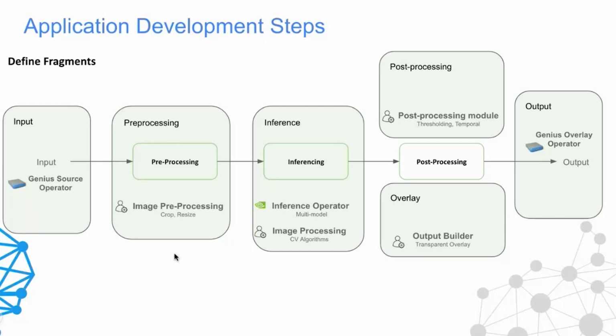Similarly, pre-processing and inference have both been put into the same fragment. Post-processing has been broken down into two fragments, one for the temporal thresholding and the temporal feature aggregation module. The second one is the output builder. And finally, the Genius overlay operator is put into the output fragment.